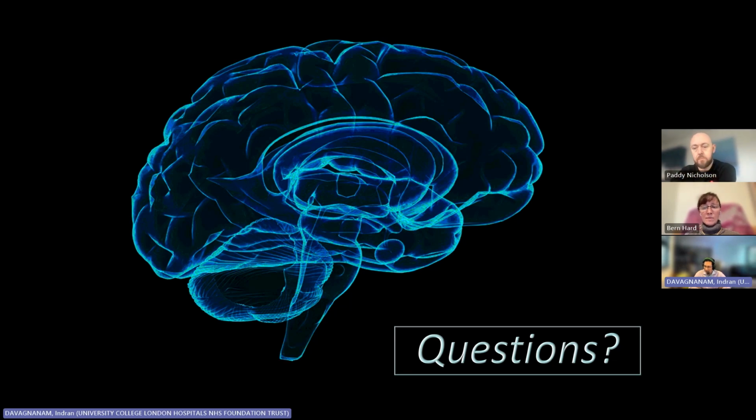So I think things evolve, but as of now, we're throwing everything at it in terms of just looking for these meningeal diverticuli. But in terms of taking things forward, in terms of further imaging, I'm not sure it adds any further value. Moving on to myelography really is, for me, the next step. That's a much more dynamic process rather than a static image. So it can be very useful in terms of assessment, doing the myelography rather than post-processing or doing much more on the MRI scan.